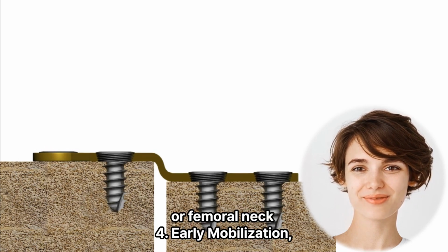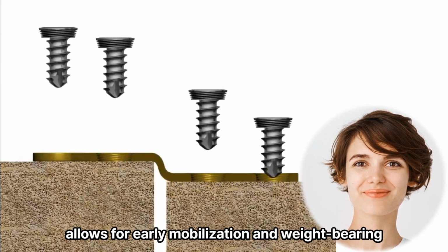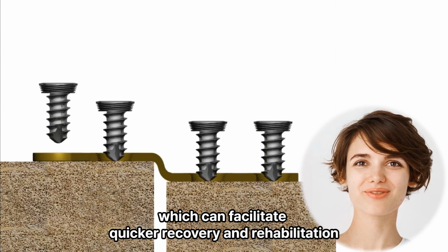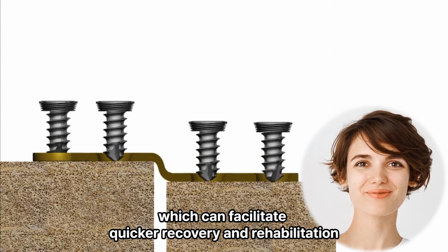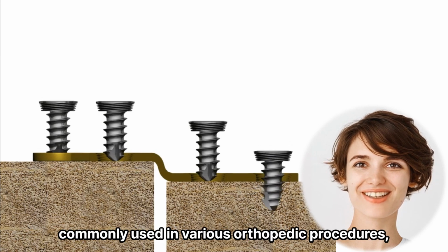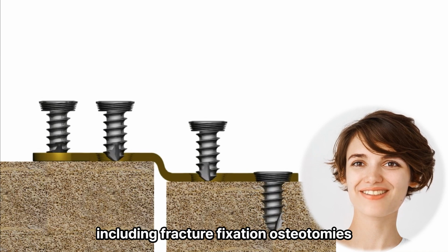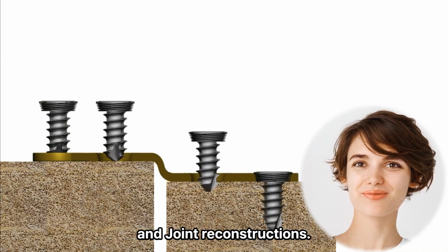4. Early mobilization. The stability provided by locking plates allows for early mobilization and weight bearing, which can facilitate quicker recovery and rehabilitation. Locking plate and screw fixation is commonly used in various orthopedic procedures, including fracture fixation, osteotomies, and joint reconstructions.